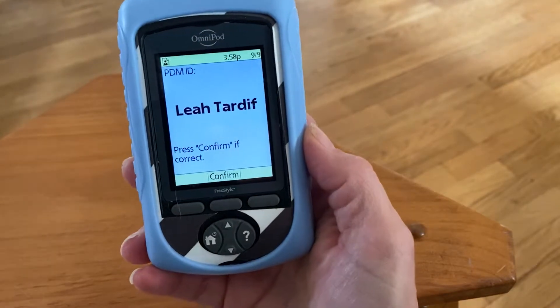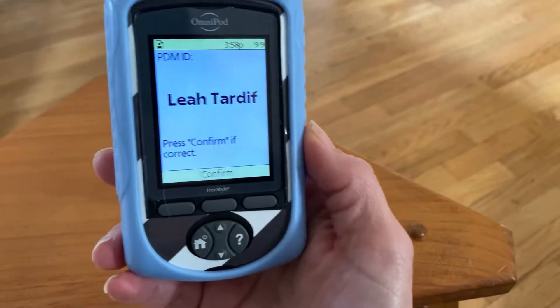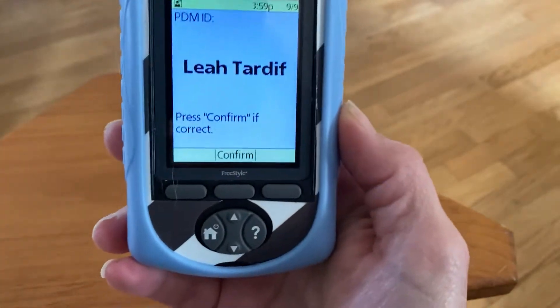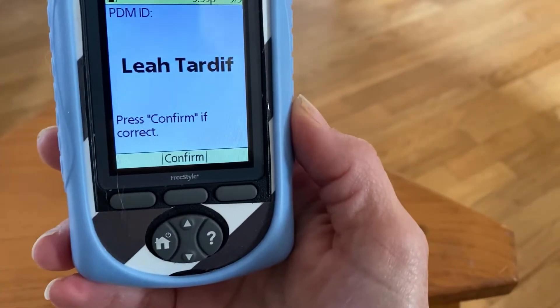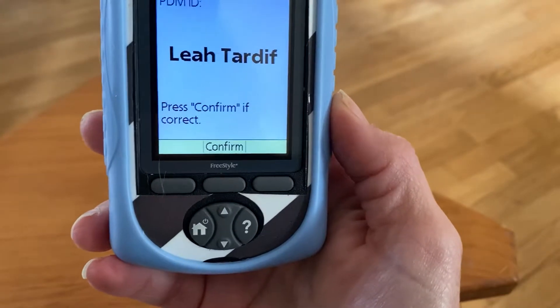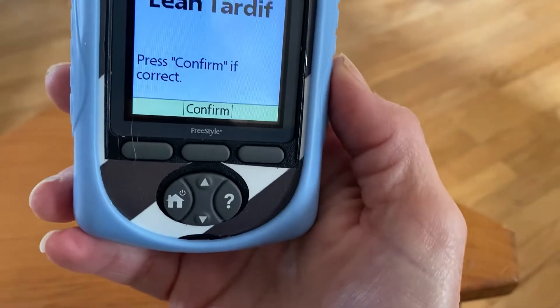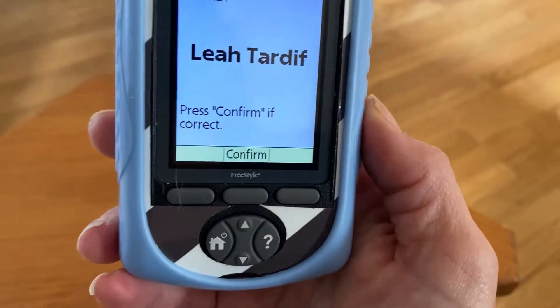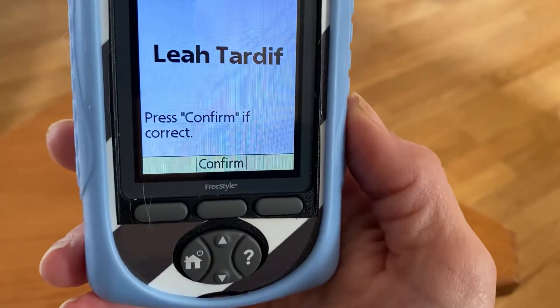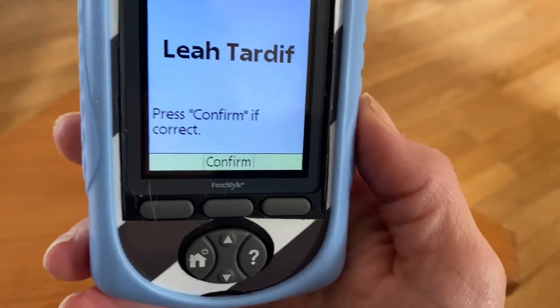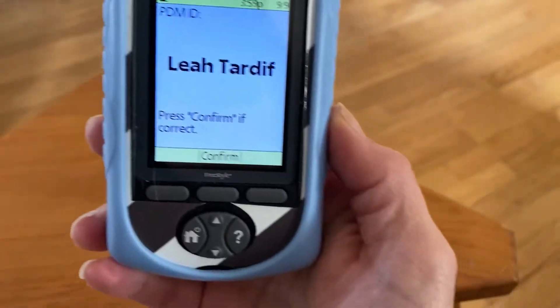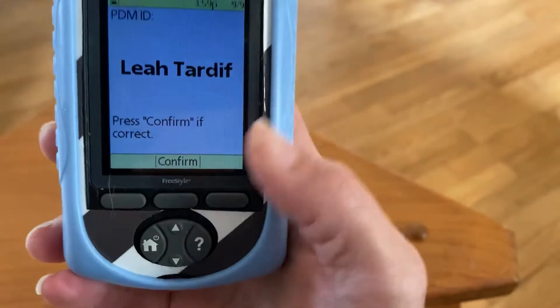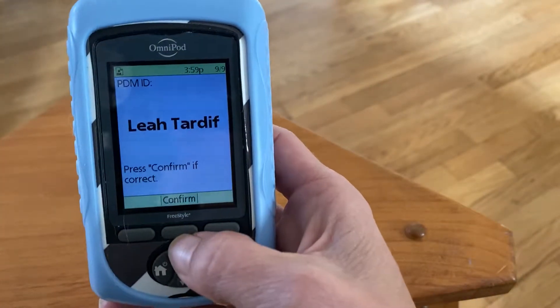One thing you can do if she is very high or very low is temporarily decrease or increase the amount of insulin being delivered depending on her blood sugar. So if she was, say, 4.1 going straight down, you could give her sugar but you could also temporarily decrease the amount of insulin she is getting in those moments, so that we're not adding insulin on top of an already low blood sugar.